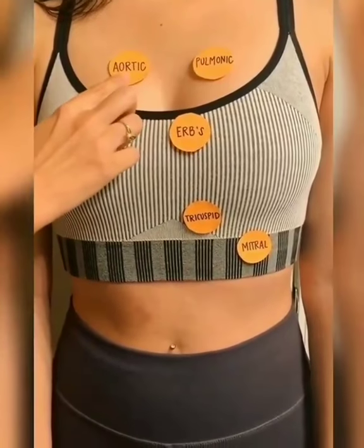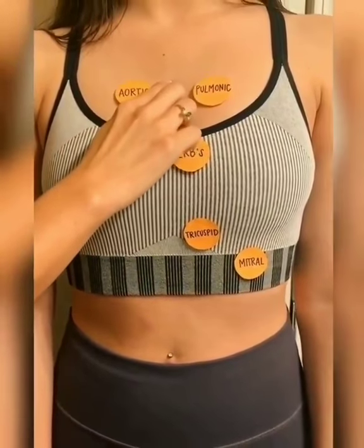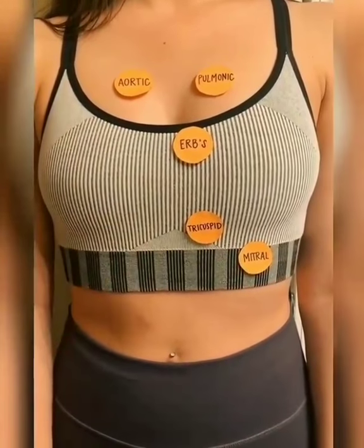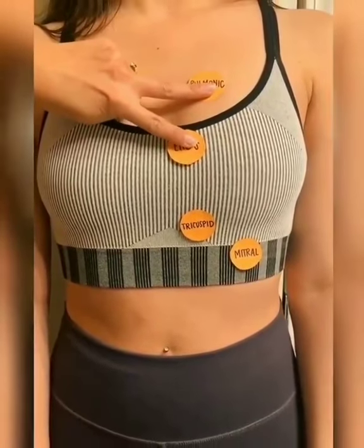The first two sounds are heard at the second intercostal space. The easiest way to find this is to locate the sternal notch, walk your fingers down until you find a distinct bony ridge, and then go to either side of that. Erb's point is at the halfway point between the base and the apex of the heart. This is at the third intercostal space, so put your fingers in a peace sign at the second rib and you'll be able to hit this.